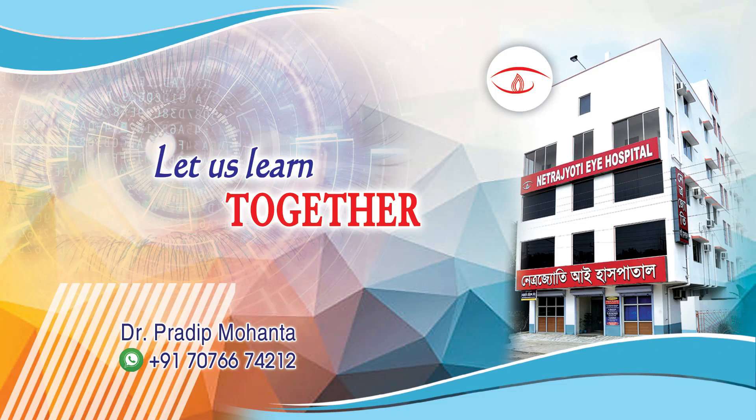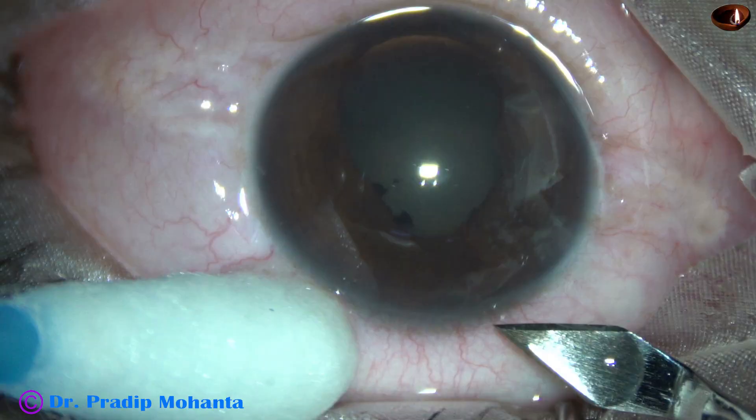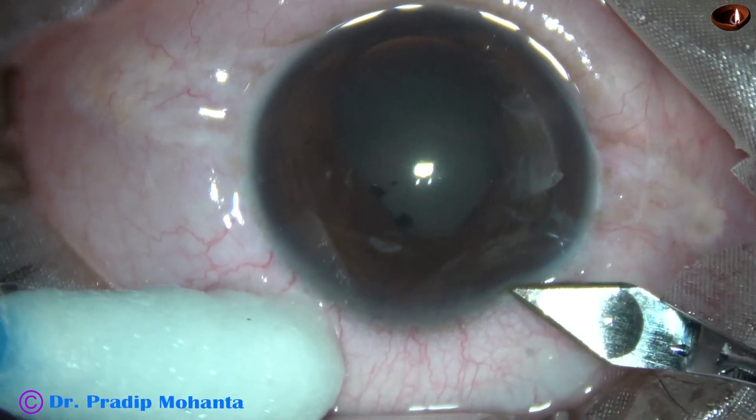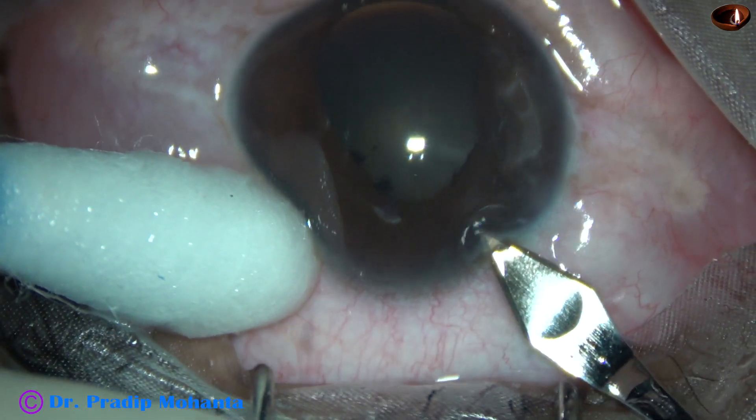Friends, welcome to my workplace at Ranagh Heart, West Bengal, India. This is a traumatic subcapsular cataract with posterior synechiae. Let us observe this surgery. This is an edited video.